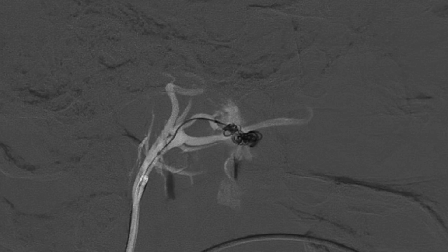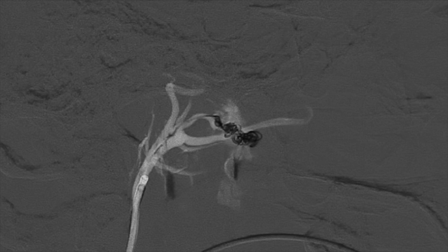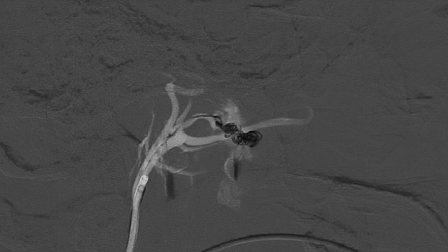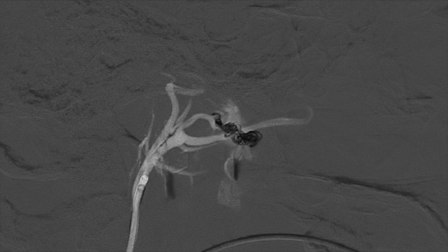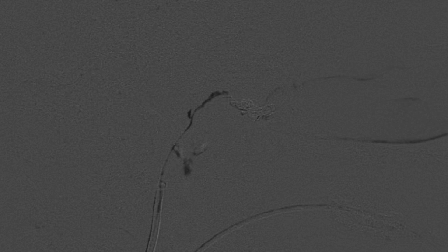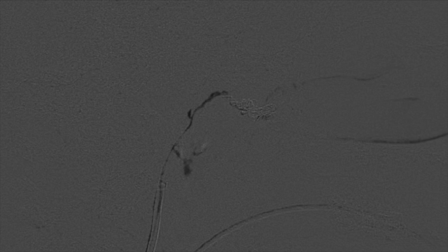We continued with coil embolization. Once it was clear we had achieved coil embolization of the actual arteriovenous connection, we proceeded with embolization using a liquid embolic agent — ONIX-18. Because we had achieved such dense packing of the fistula with the coils, less than 0.3 cc of ONIX-18 was needed to completely occlude the arteriovenous connection as well as the feeding artery to the fistula itself.